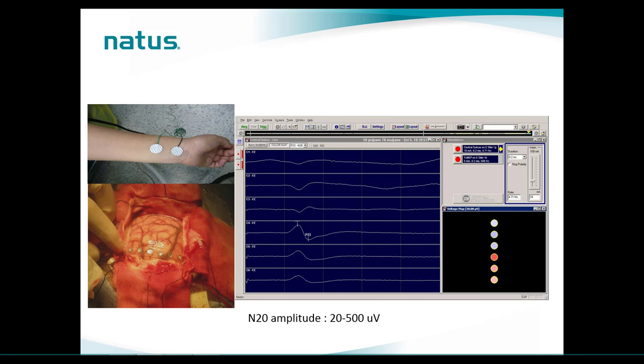We measure the N20 or P20 amplitude, and where the highest amplitude difference occurs is where we see the phase reversal. On this screenshot, you can also see on the right side that some systems provide a visual aid to see the phase reversal more efficiently — the redder the color, the higher the amplitude difference between contacts. The N20 amplitude is quite large because we are recording directly from the cortex; it can be between 20 and 500 microvolts. If you cannot see the polarity reversal on the eight contacts, you will need to reposition the strip and repeat the test.